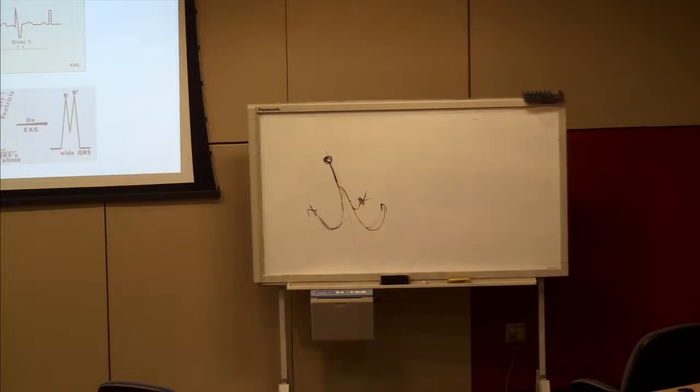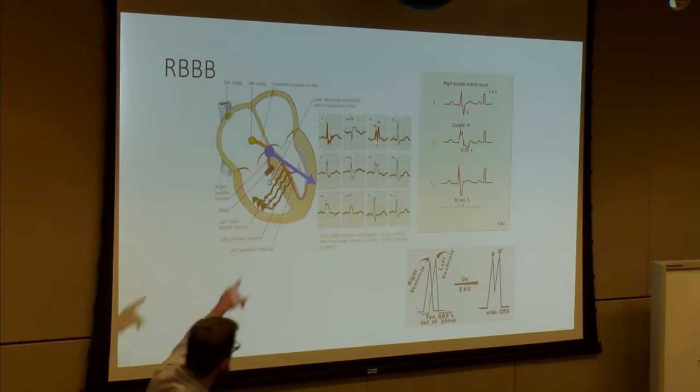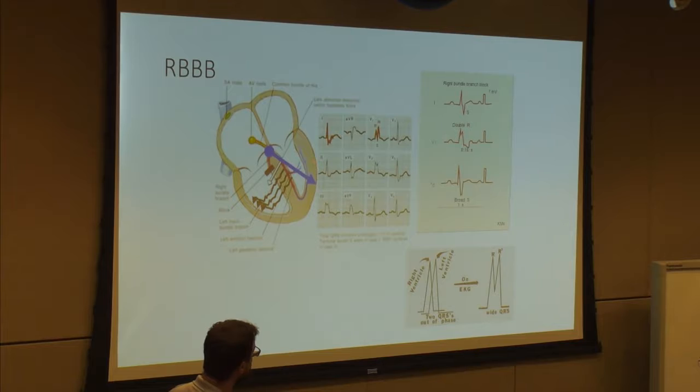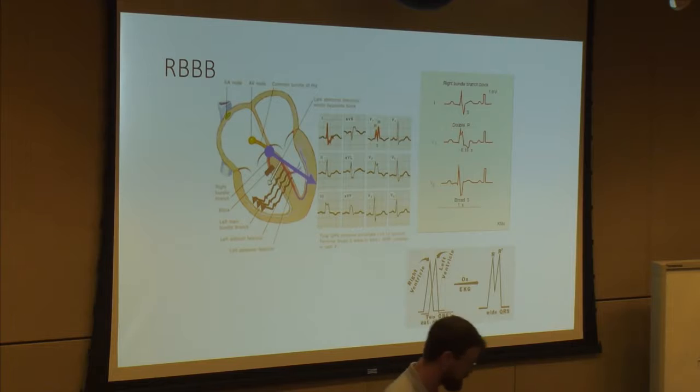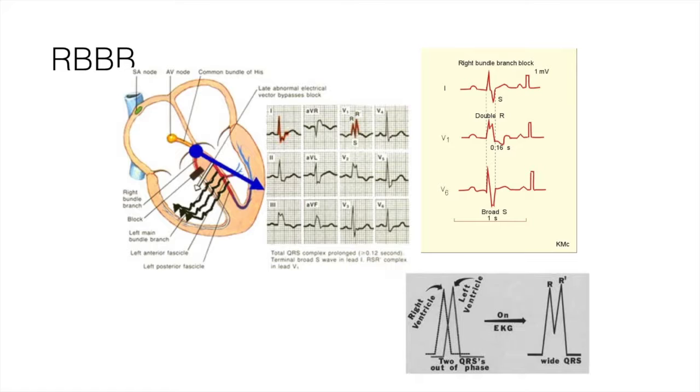So when I talk about right bundle branch block, what does it look like? I have fast depolarization of my left ventricle because my left bundle is intact. I have slow depolarization of my right ventricle. So slow depolarization of the right, fast depolarization of the left. I take what is usually a synchronized depolarization of left and right ventricles and split those two apart. I uncover the two ventricles, and I end up with an RSR prime. Make sense? Everybody got that?